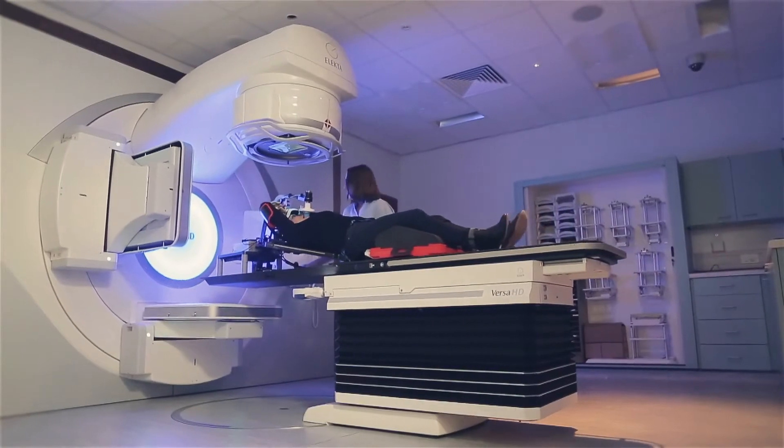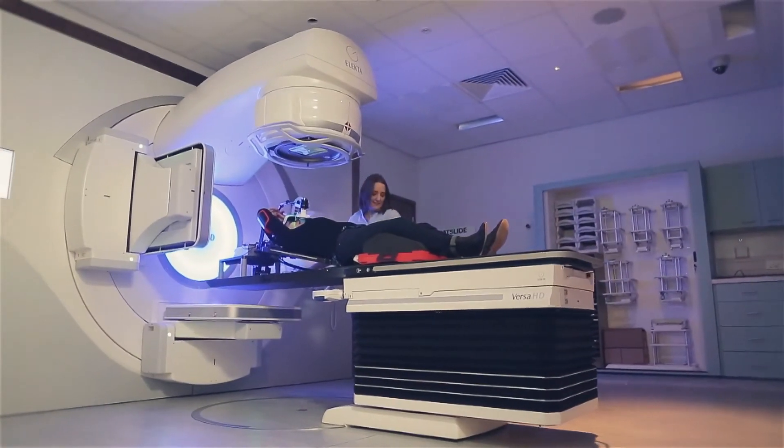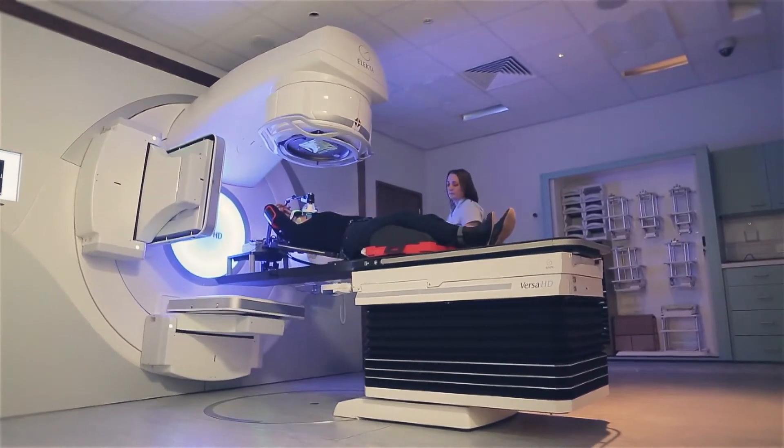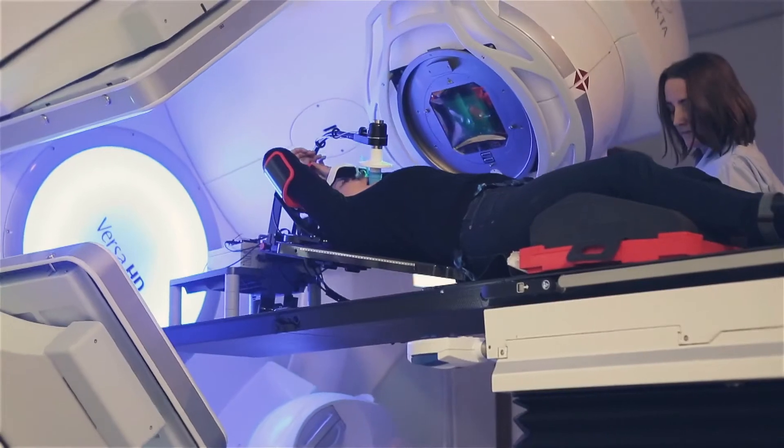At Cancer Partners UK we are using a breath hold technique which is used primarily for left-sided breast cancer patients. The technique is simple and easy for the patient to use. The patient is in control of the system at all times; at no point are they forced to hold their breath.